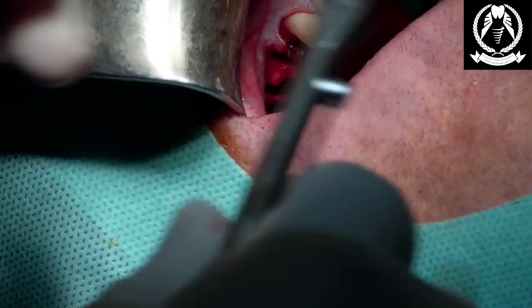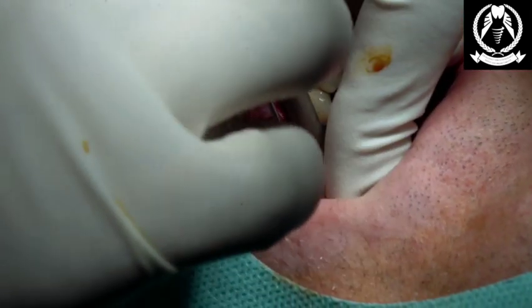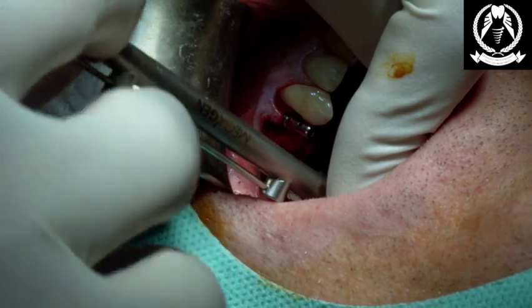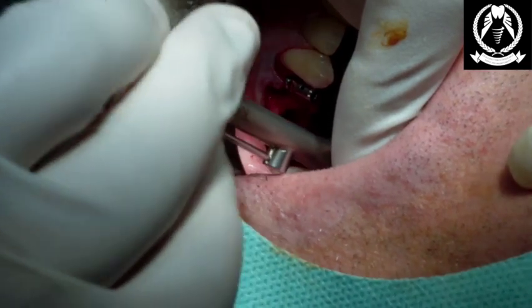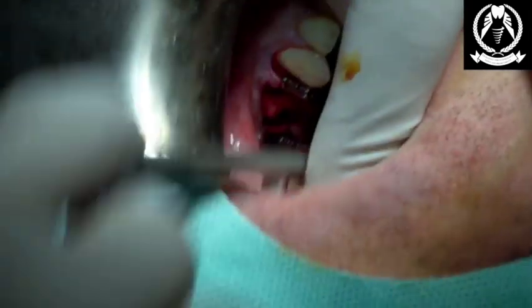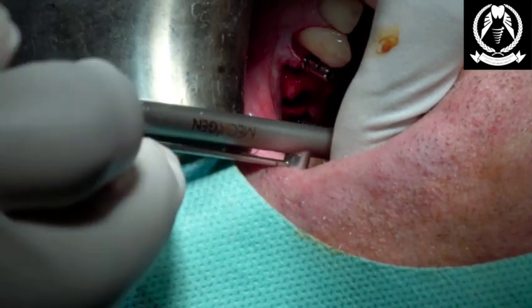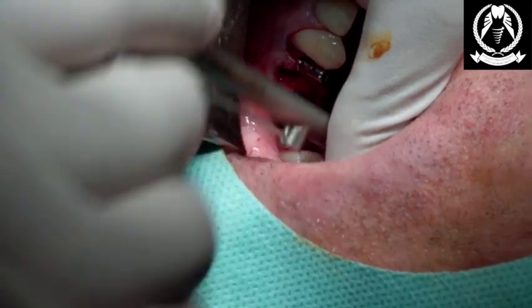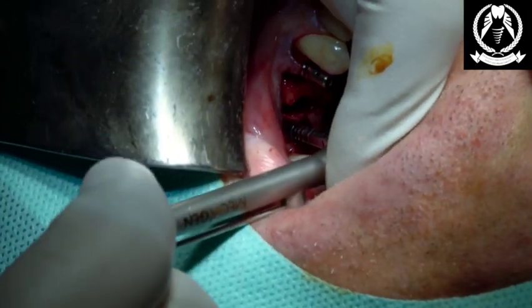Okay, Alan, how we doing, buddy? Alan, are you there? Yeah, good. Hello, welcome home. Right, so I'm just going to relax that fit a little bit because it's nice and tight. Just going to take it out a wee bit. Just going to wait. Bone has the property of being viscoelastic, so it does adapt. And I'm going to go back in with this implant. Really nice and firm. I'm just a carpenter. See? There we go. How you doing, Alan?